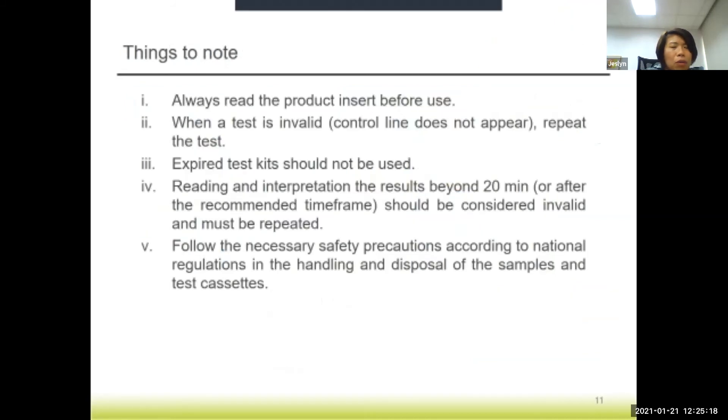A few things to note when doing this test: always read the product insert before use. There are quite a number of test kits on the market currently, and different manufacturers will have different instructions. Some kits need to be kept at 4°C; some can be kept at room temperature, so you may need to bring the product to room temperature before use. Always remember: when the control line is missing, the test is invalid and must be repeated. Make sure you do not use an expired test kit.